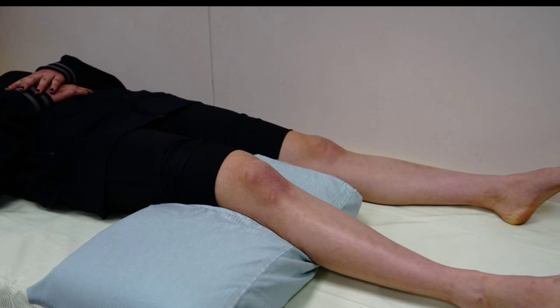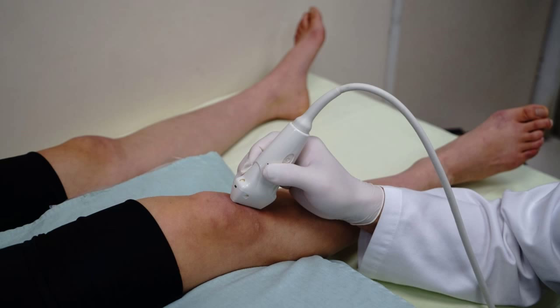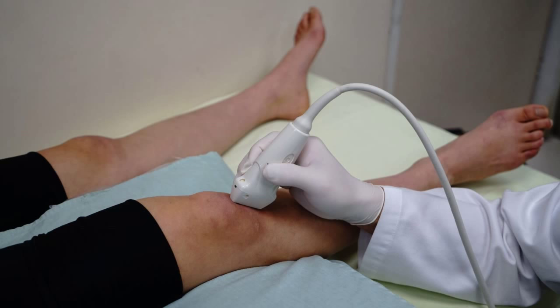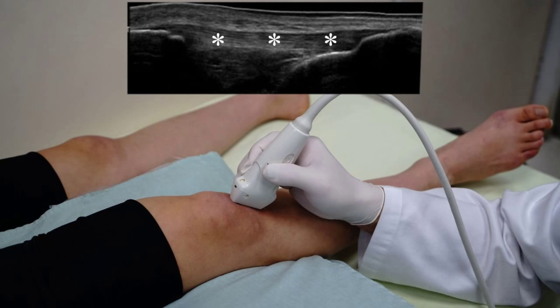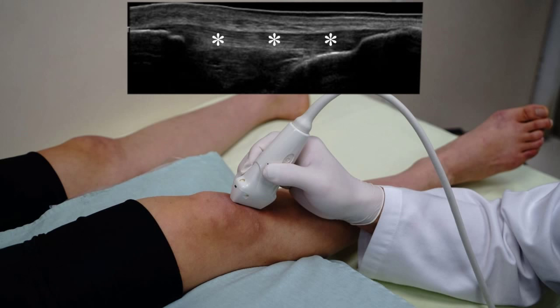Beginning the examination. The patient is positioned supine on the examination table with his or her knee flexed. Scanning of the knee starts from the patellar tendon, which is used as a landmark in this examination. The tendon is displayed by sonography as an echogenic band with a fibrillar appearance in longitudinal views.